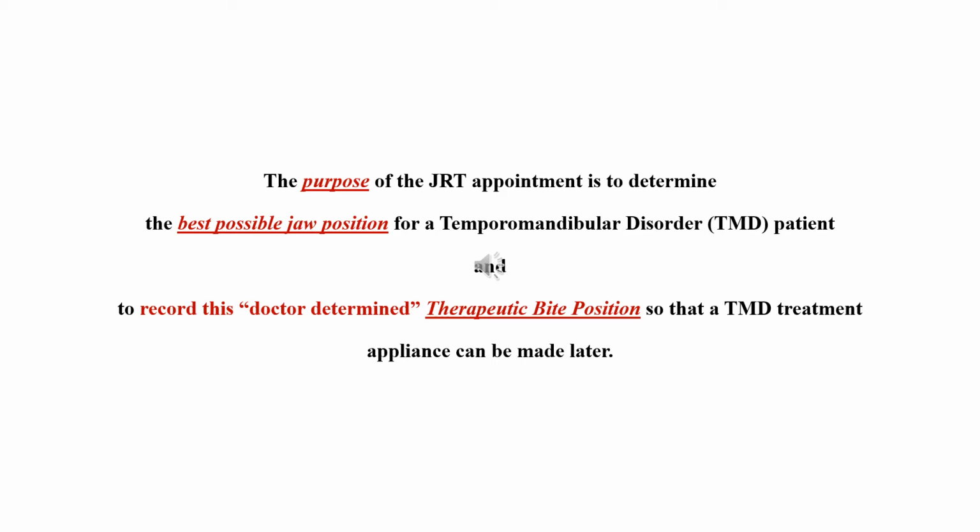Bite means when they bite down into my position versus their maximum intercuspation, where all the teeth fit together. It's a different position, the therapeutic bite position, recorded so that a TMD treatment appliance can be made later.